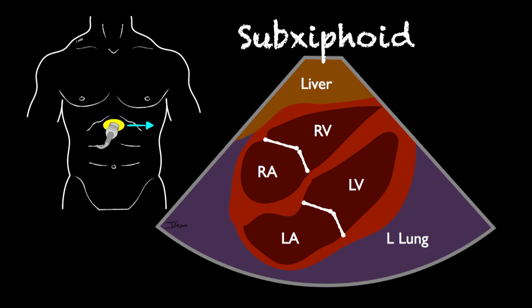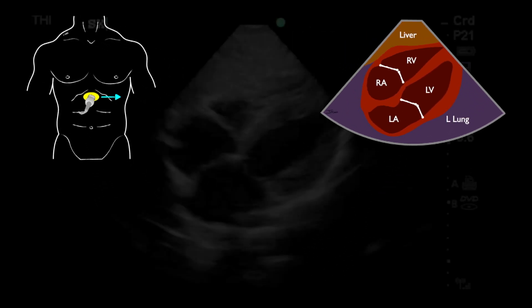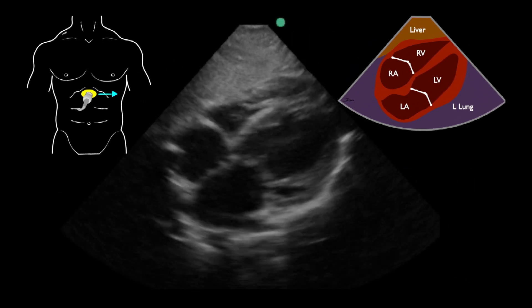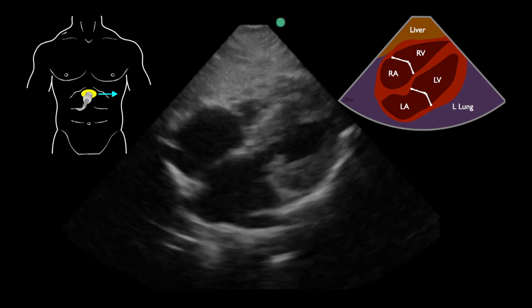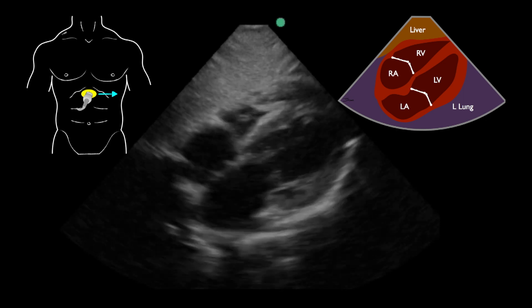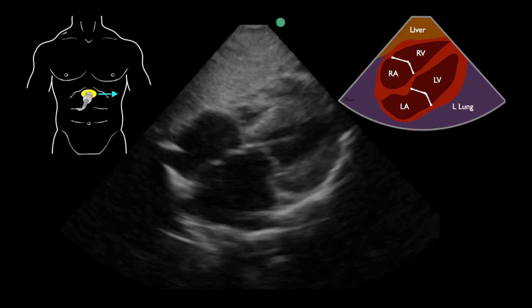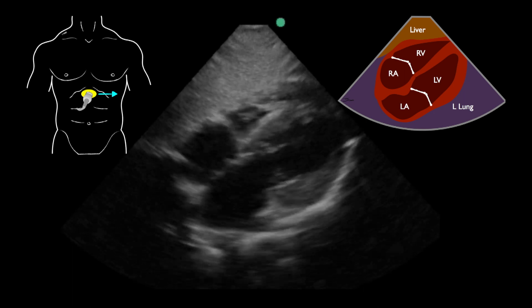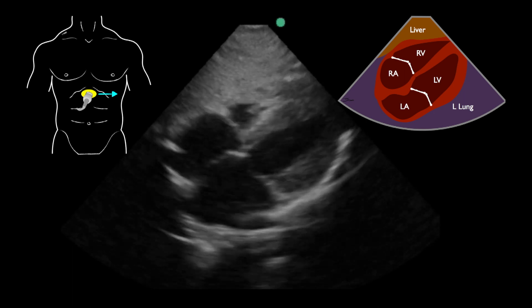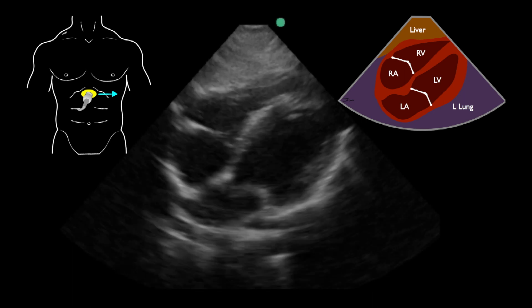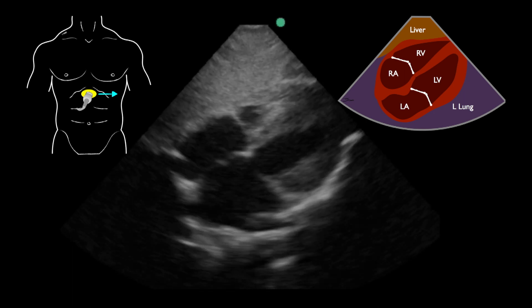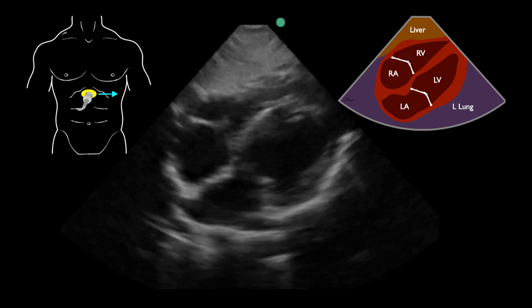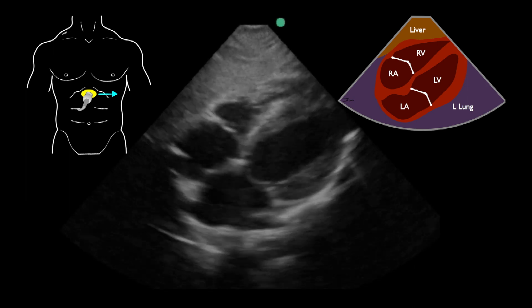This view allows us to assess the global function of the heart. It allows us to look and see if there's any surrounding free fluid or pericardial sac fluid, and also allows us to look at the chamber sizes — several of the binary questions we have when performing a cardiac ultrasound.